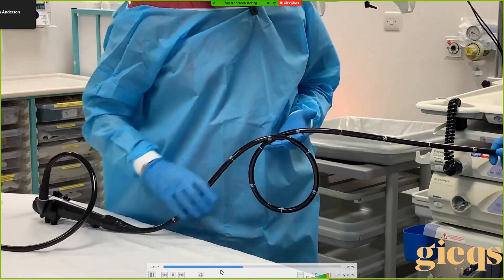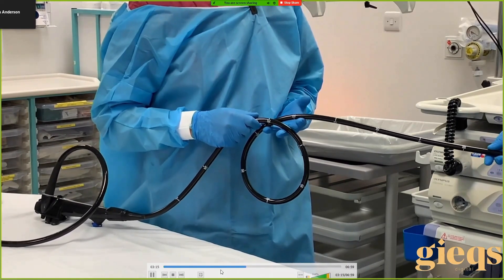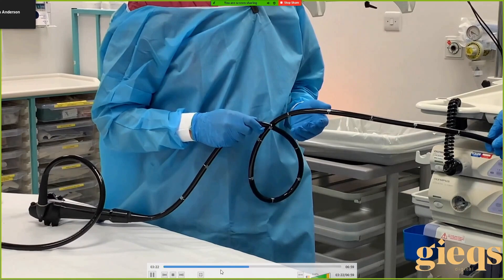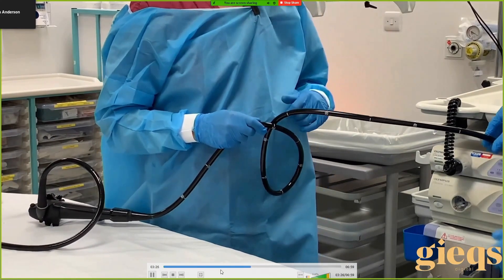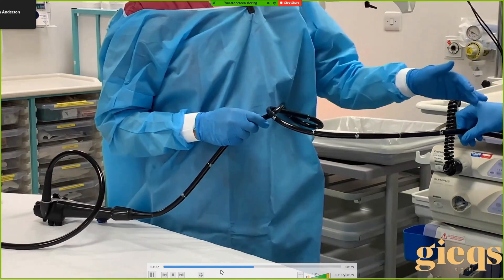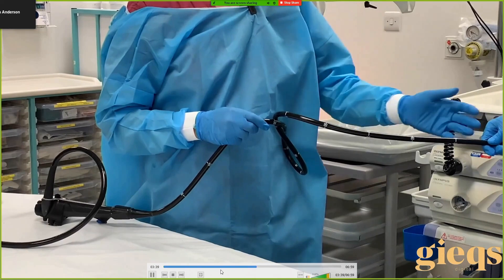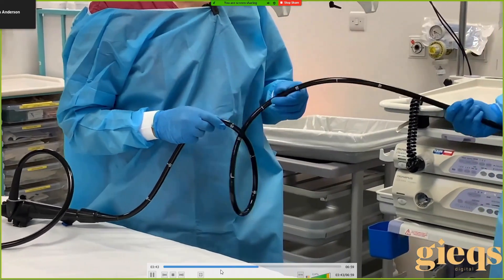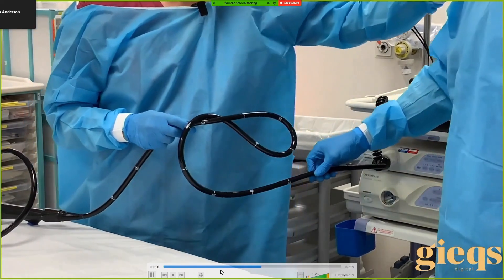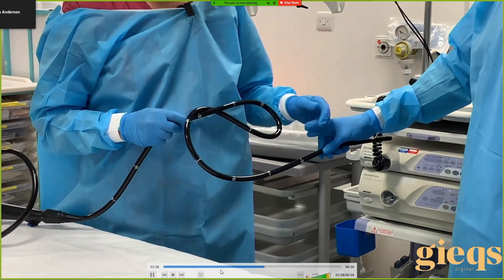It's clearly a clockwise torque needed here, but let's say you're not sure and you apply anti-clockwise first. What do you feel? It's very hard — there's a lot of resistance. As a trainer I might say put more torque on, but what's actually happening? There's a limit — the resistance is increasing, it's really difficult to apply the torque. What happens to the length of the instrument? It's shortening. Your hand comes forward and your nose gets closer to the patient's anus — we definitely don't want that.